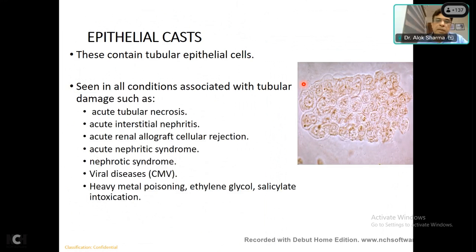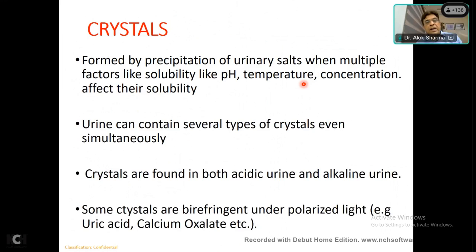So you can have epithelial casts, nothing great about it, but you should be able to identify them, basically, not to confuse them with any other condition. Now lastly, crystals. So we'll quickly go through the crystals.